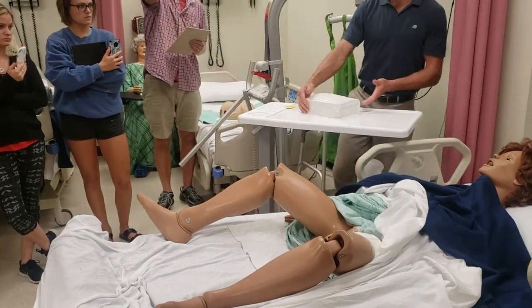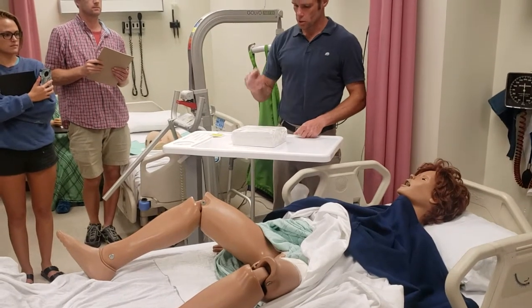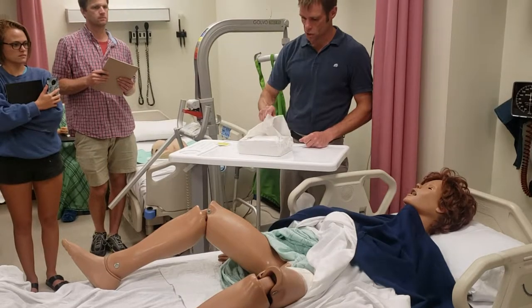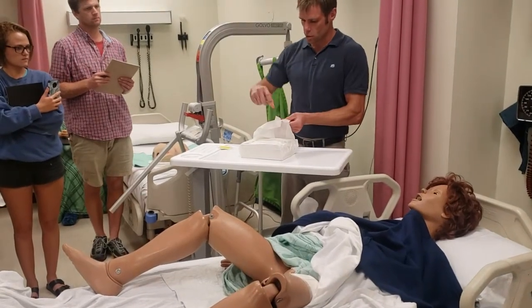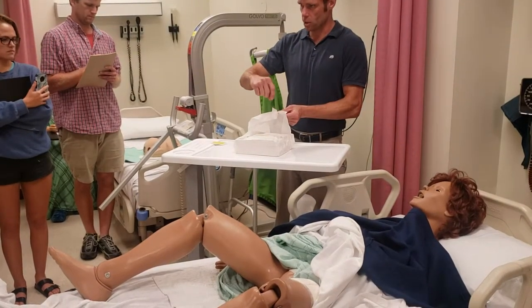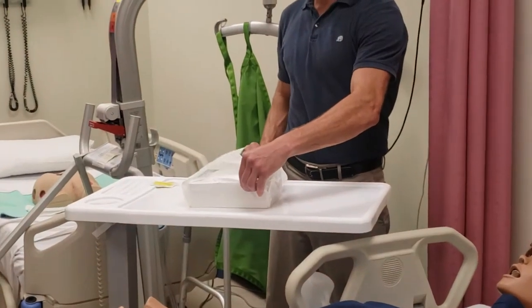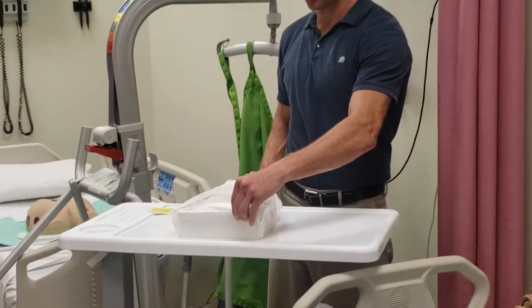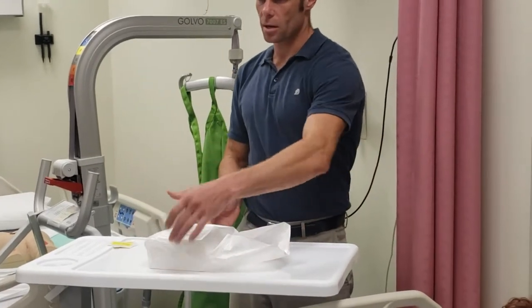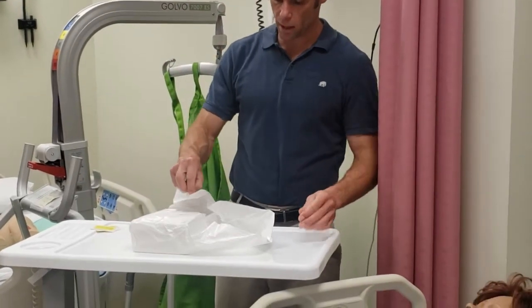I'm going to open it up backwards — which way do I open? Towards or away? Towards. I don't touch the one-inch border. You gotta pinch here, because what's natural — what you want to do — is grab there, because that's how we open everything in our lives. You can't grab there; that's the one-inch border. So I gotta pinch here, and when I pull it back I'm grabbing what's going to be on the outside. Just like when I open my sterile gloves, I break the seams as I open this up.